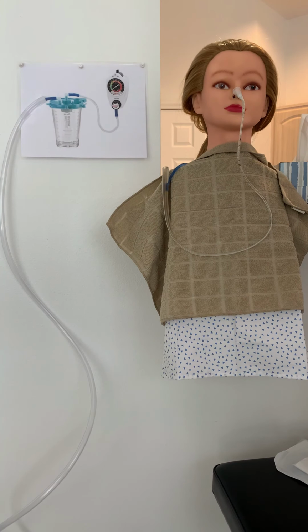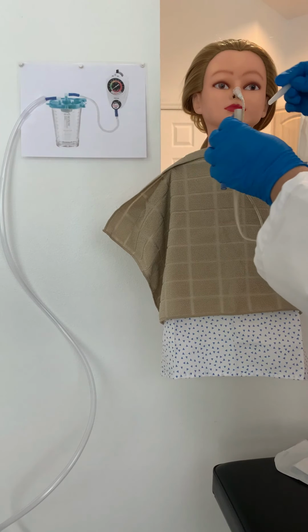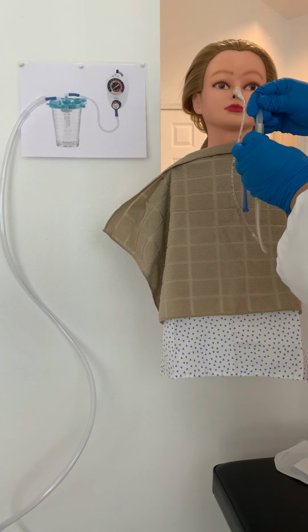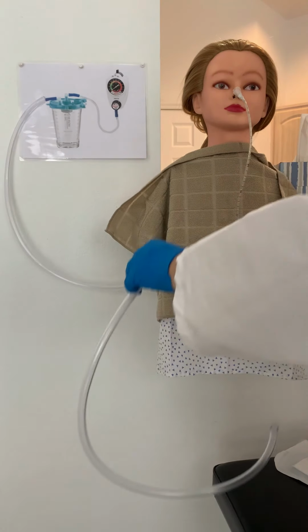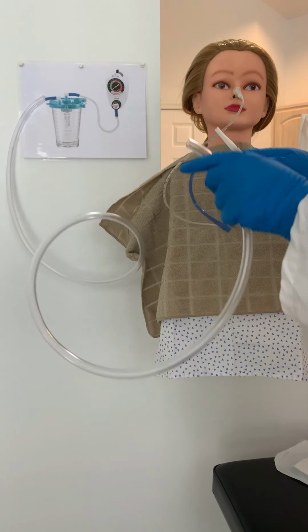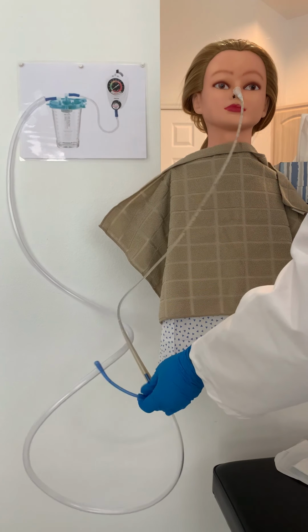Now I want to connect it to my suction, or my suction tubing. So I want the connector, and I'm just going to place that in here. And then the end of that is going to connect into my connection tubing there. Okay.